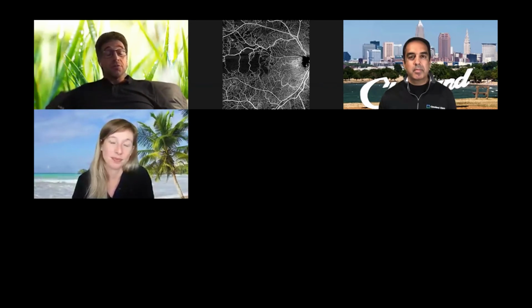For us, I would say the number one differential diagnosis is a circumscribed choroidal hemangioma. These can be difficult in the retina practice sometimes to recognize, and yes, I would say that's the main reason that we order the ICG. In other circumstances, it is to prove that this is not a tumor.